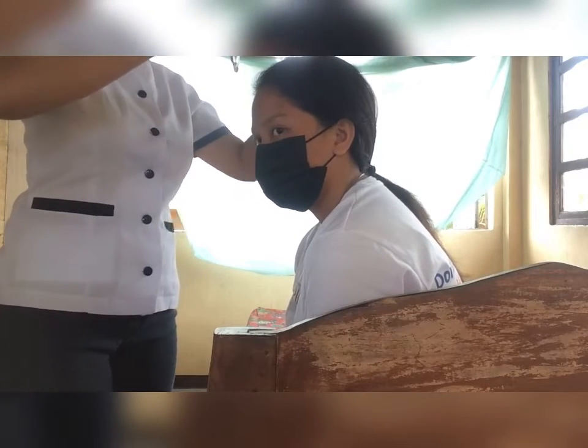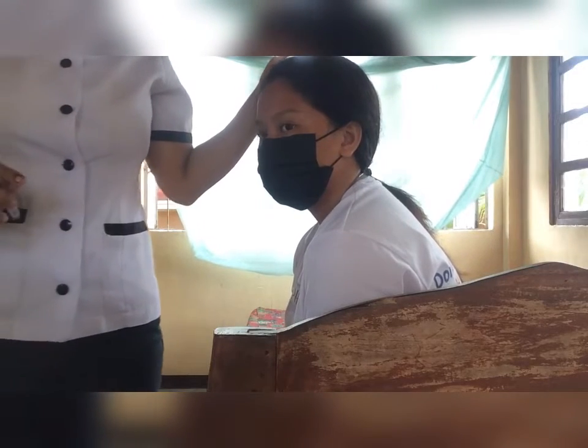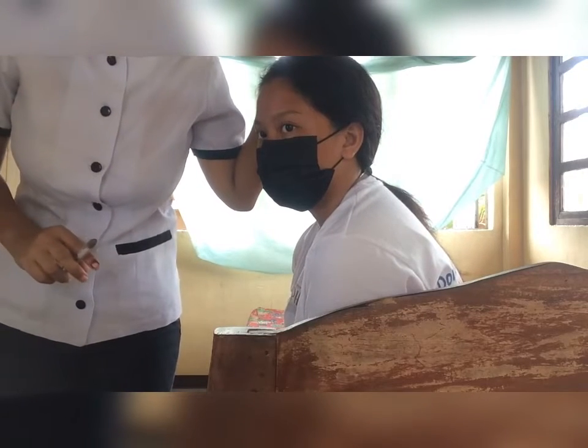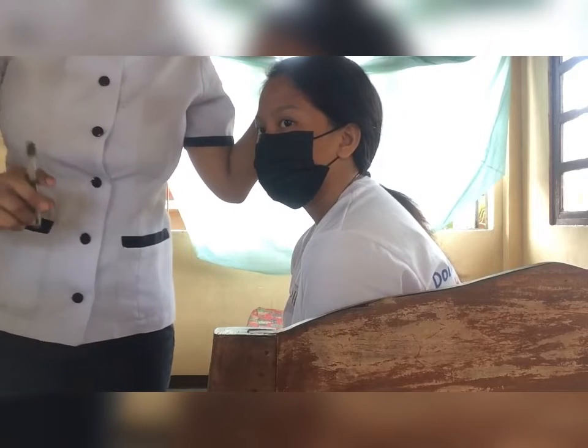And then next, compare air and bone conduction by performing the Rinne test. Place a light vibration of the tuning fork on the mastoid bone behind the ear at the level of the ear canal, and then quickly place the vibrating fork near the canal and ask if the sound can be heard.